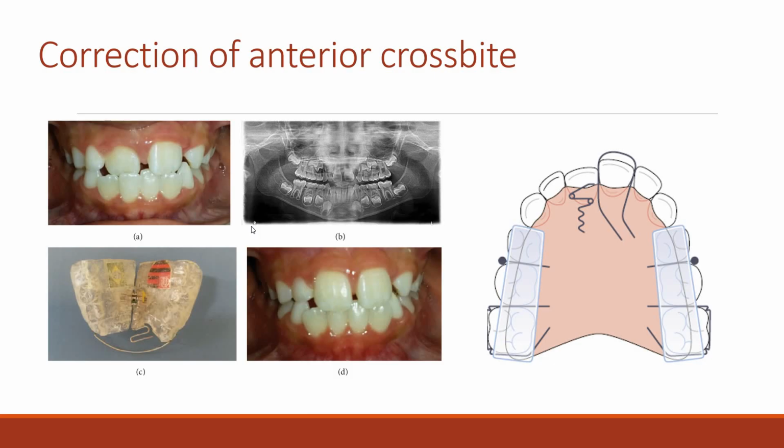For instance, expansion removable appliances can provide an effective method for expanding the maxillary dental arch, particularly in the mixed dentition. The patient activates the appliance by turning a midline screw until the crossbite is overcorrected, with the palatal cusp of the maxillary buccal teeth occluding on the incline of the buccal cusps of the mandibular teeth. Following expansion, the posterior capping can be removed after a while, and the appliance worn at night for a period of 3 to 6 months as a retainer.